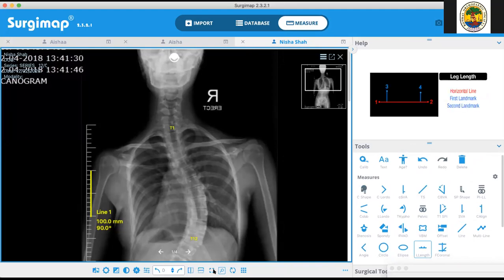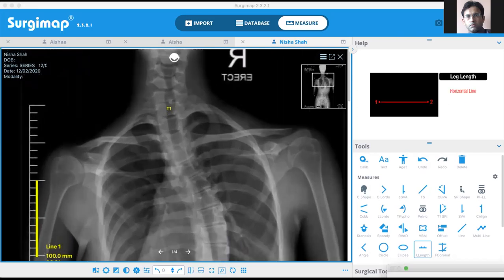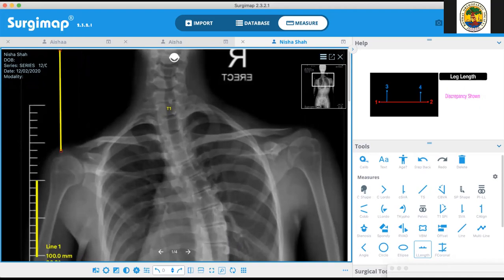It would probably be better to enlarge it a bit so that we get the exact point. Then you come from the very top of the X-ray, and draw a line to the top of the acromion. Amit, first draw a horizontal line. Not required, Kshitij, because we just need to ensure that we are perpendicular to the lateral edge. That the tool will only do. If you draw a horizontal line. Okay. Got it.